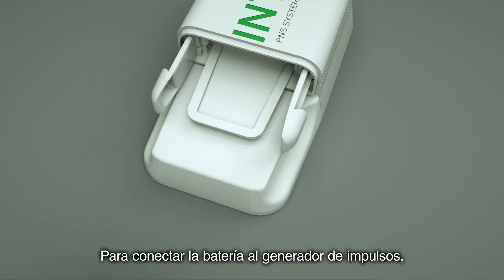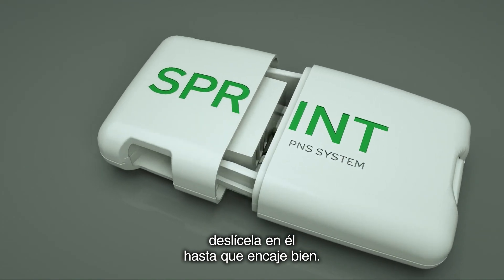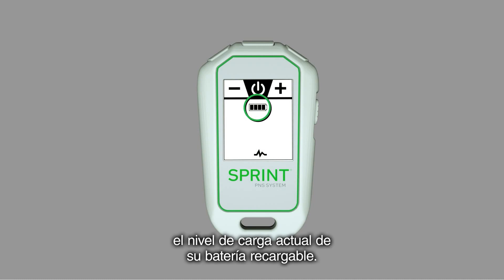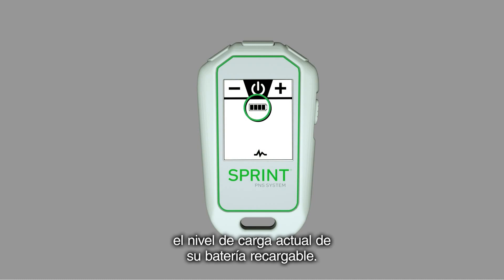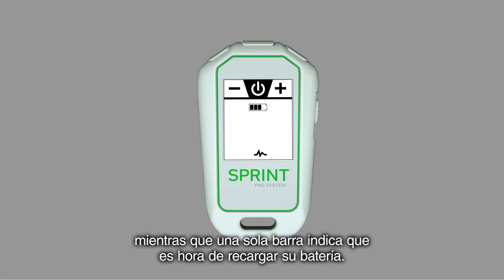To connect the battery to the pulse generator, slide the battery into the pulse generator until it clicks into place. The battery icon on the handheld remote will indicate the current charge level of your rechargeable battery. Four bars indicate a full battery charge, while a single bar indicates that it's time to recharge your battery.